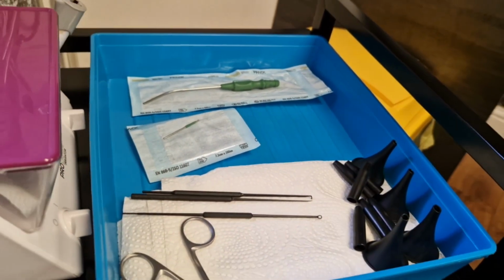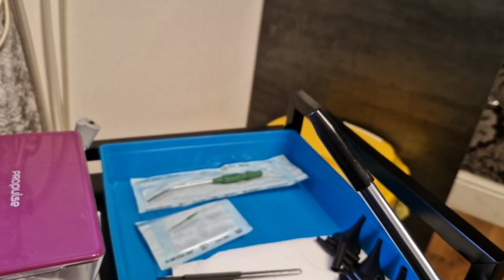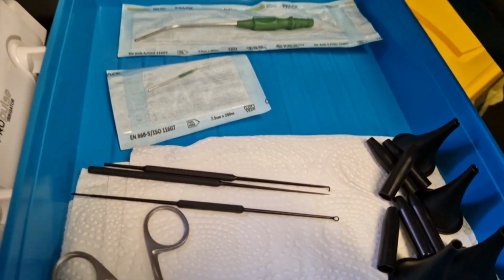These are just little caps, because there's a little video otoscope here. Now this thing I can just put in the patient's ear, and that projects it to the giant screen that you've seen behind you, so they can see the before and after. I've shown the video of it on the endoscope too.